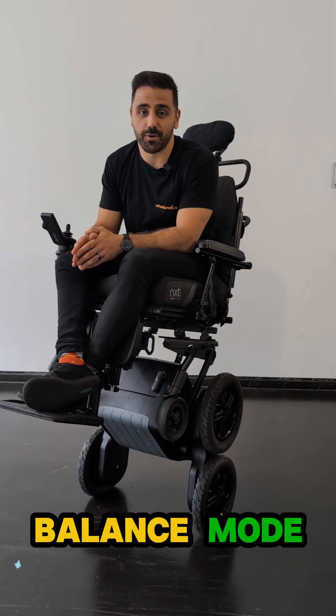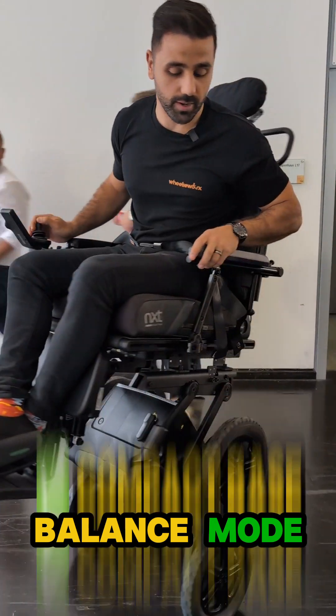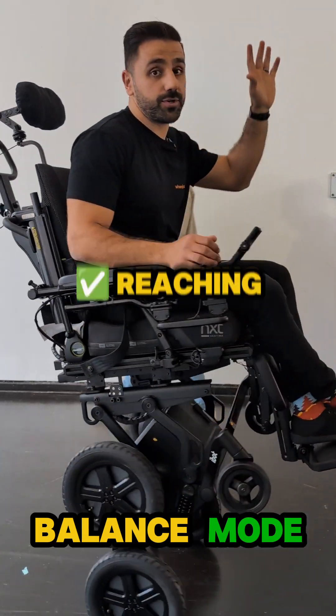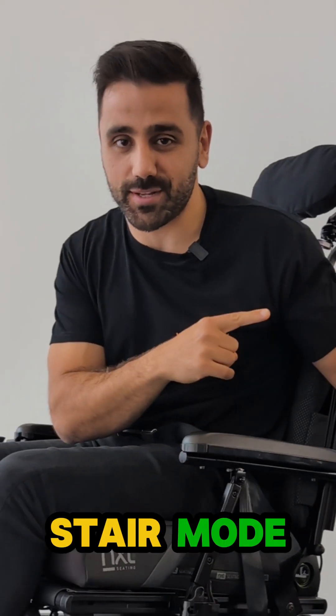This mode is called balance mode and whilst it looks cool, it's got some functional purposes. The fact is that if you're in a small environment, you've got a quite compact base. You are now higher for reaching, for social engagement, all the great things with seat elevation. But then there's another mode and that's stair climbing mode — let's go check that out.